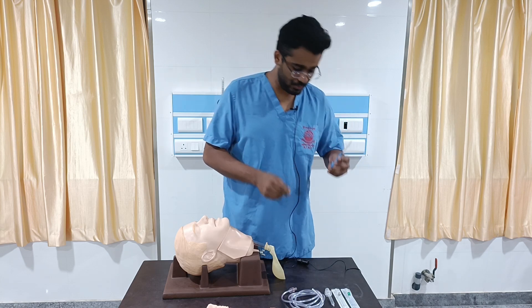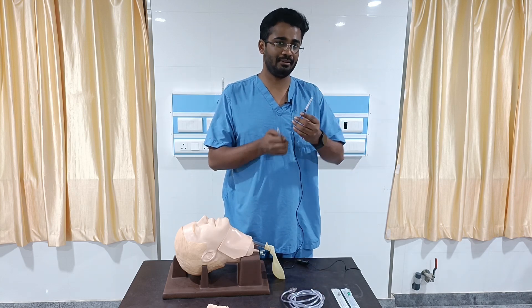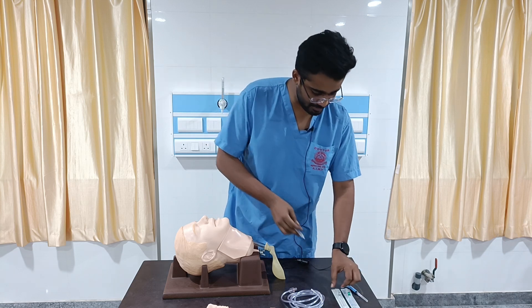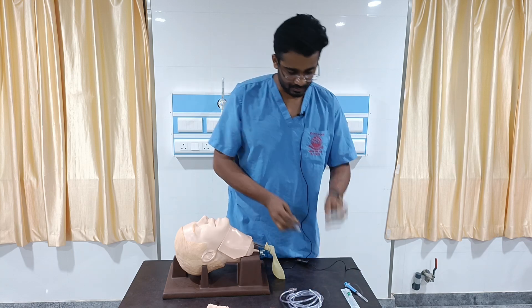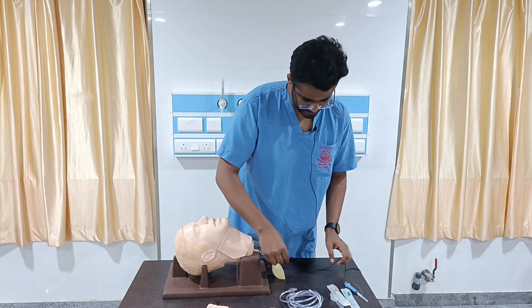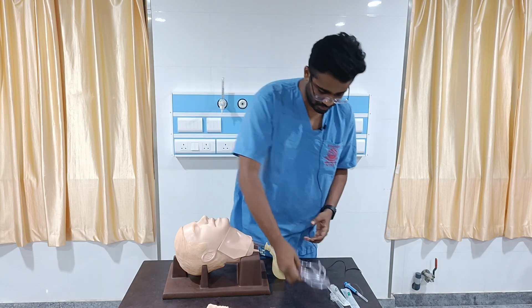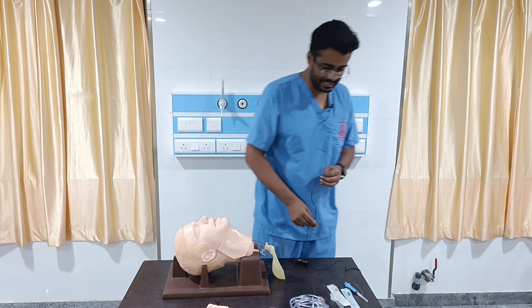We will be needing a 2cc syringe — one for checking backflow of air and the other for ventilation. We will also need a 16 gauge cannula and an ET tube connector, which is needed for the connection between the syringe and the airflow tube.